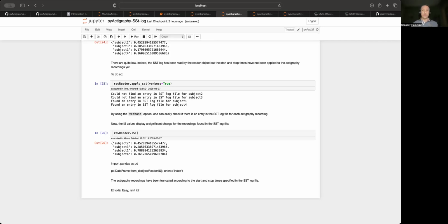If you want to have something that actually, you should use that one, the SADE, but the SADE, a long time ago, was devised on a device that most likely does not exist anymore. If I remember correctly, even the acquisition mode was different than the one that is used in most devices now. So it's always difficult to say it has been validated because that's been validated in a certain context that is sometimes hard to translate to a new context. So maybe you are as good using that one as another one that is more suitable to your device. So that's really a difficult question at the moment.